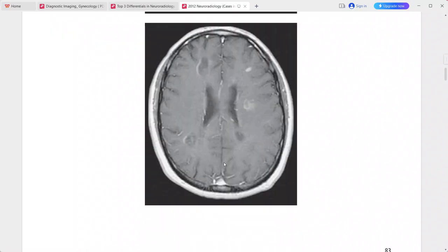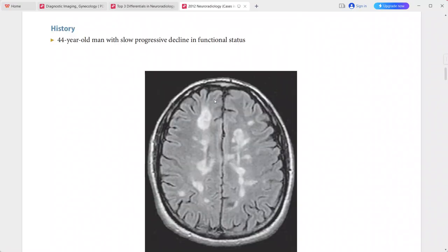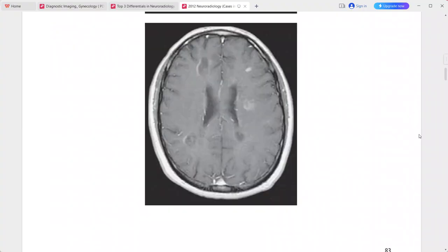Post-contrast shows rim enhancement around some lesions, which is incomplete in some areas. This is a case of multiple sclerosis.